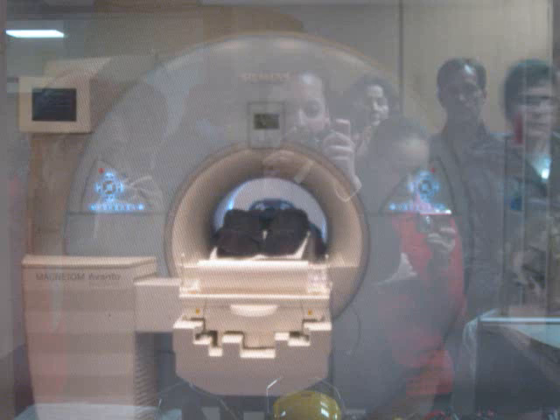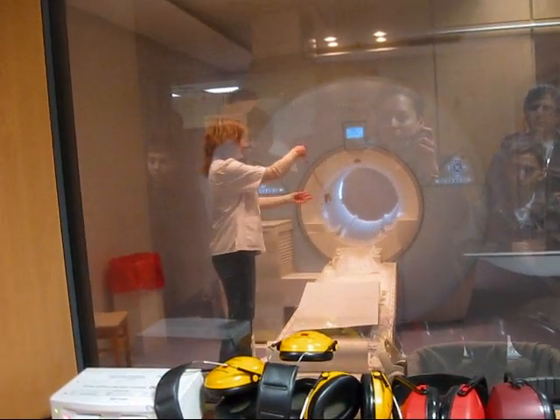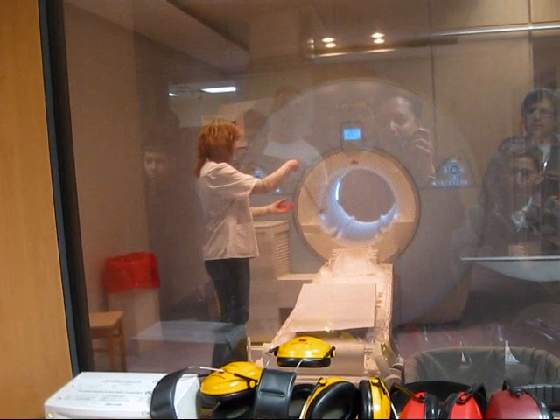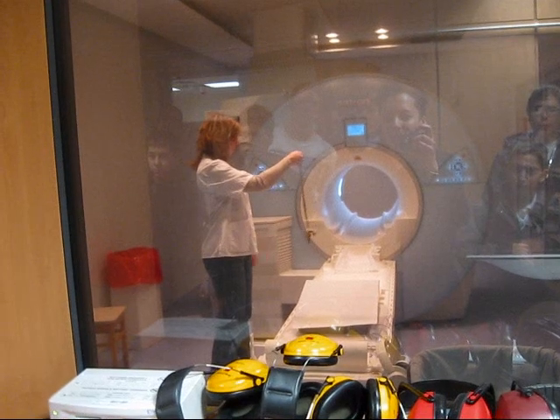This video is about how MRI, magnetic resonance imaging, is done. This is a display of the strong magnetic field at idle, demonstrated using a key. As you can see, the magnetic forces are very, very strong.